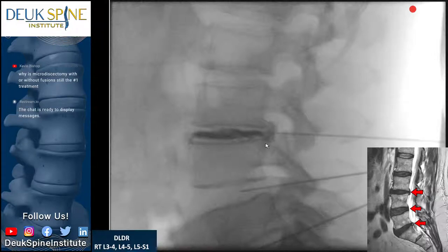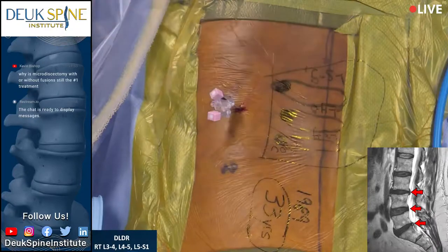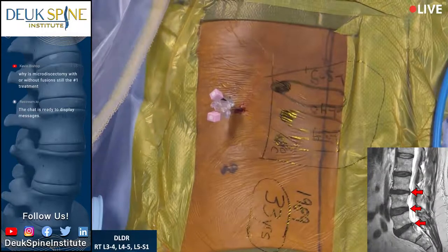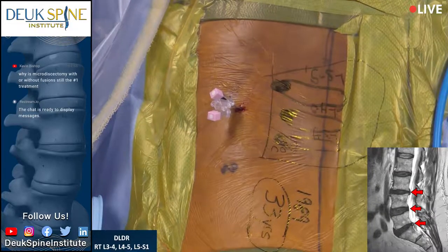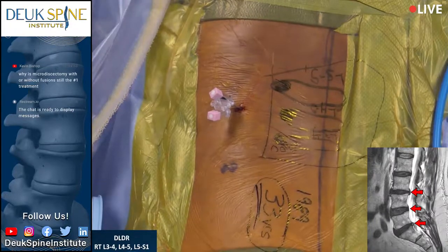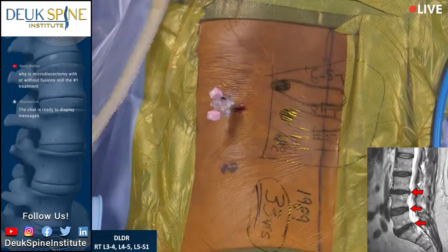And the fact that the pain was concordant means that's where he gets his pain every day. It is the type of pain. And it went up to a 10 out of 10. So that means that that disc, L3-4, can actually cause on a daily basis 10 out of 10 pain. Basically debilitating pain. What do you think he's gonna do when he feels that pain start to rise? He's gonna stop what he's doing. He's gonna lay down, just like everybody else. That's why for 33 years, he's been pretty much inactive, not doing anything because he doesn't wanna set the pain off. Okay, we just confirmed that that pain is coming from L3-4, one of the three discs we're fixing.